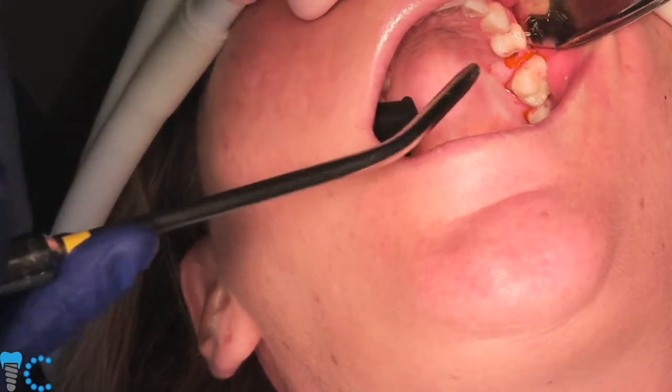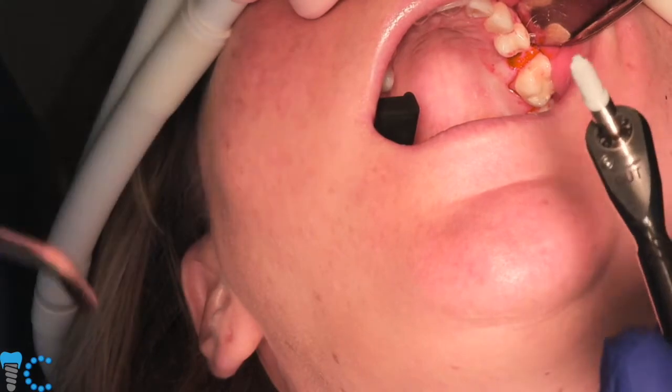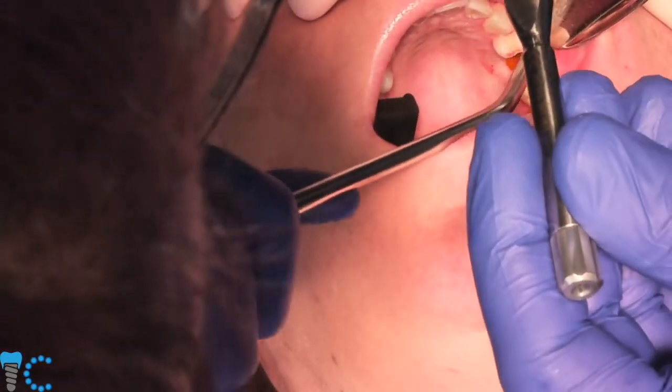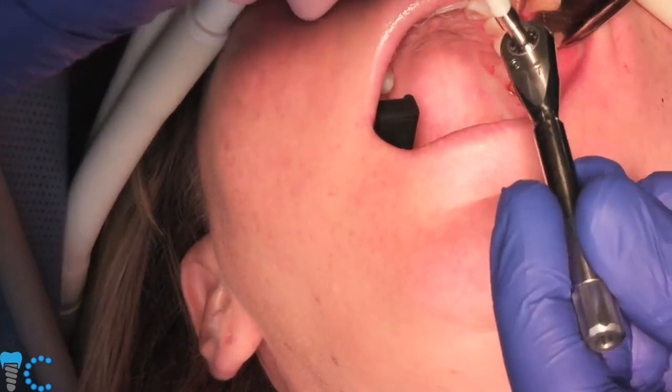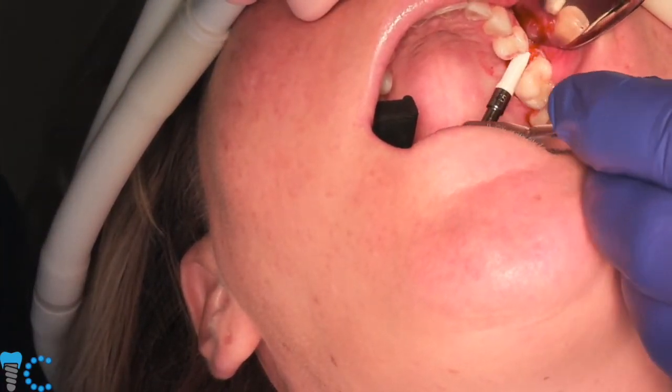So hold that for me. Get your system to hold the retractor. So my implant's snug into the placement instrument, and the placement instrument is in the ratchet, and your ratchet should be preset to about 30 Newton centimeters.